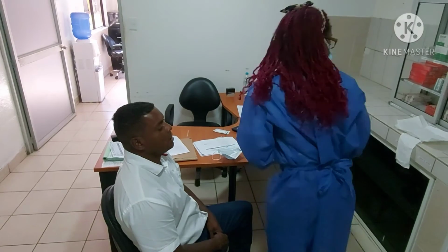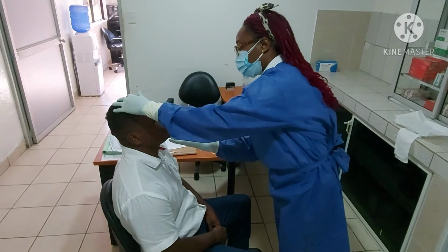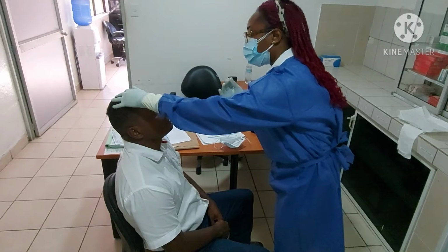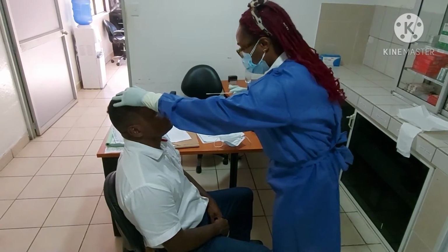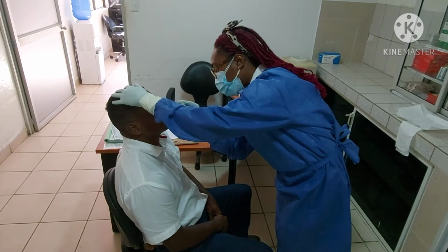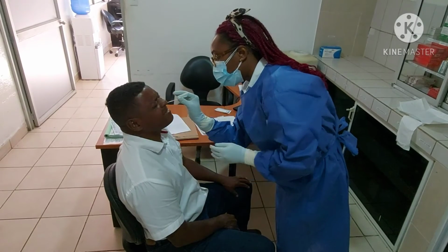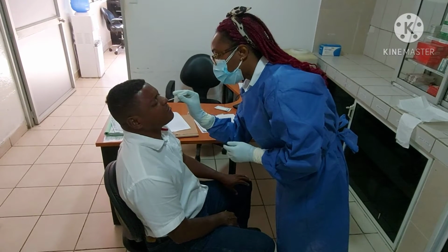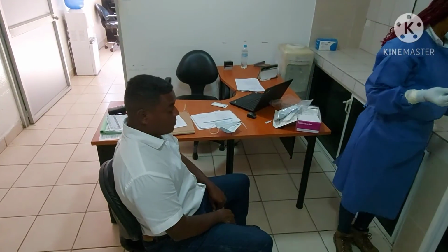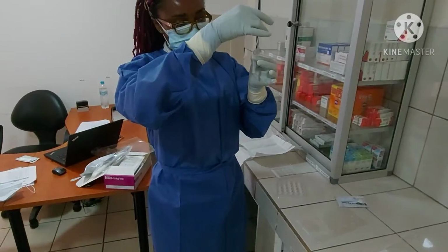So guys, once you have your gown, your gloves, and your double mask ready, go ahead and introduce the nasal swab into the patient's nasal cavity. Sorry, I had my hand over the patient's head, so you couldn't see the process of introducing the nasal swab, but you'll be seeing it in a bit. So we're going to go straight ahead and put in the nasal swab into the nasal cavity, not upwards, not downward, just straight. You're going to get to a point where you're going to feel some resistance, and at that point you stop introducing and just turn the nasal swab 5 times to get enough sample.